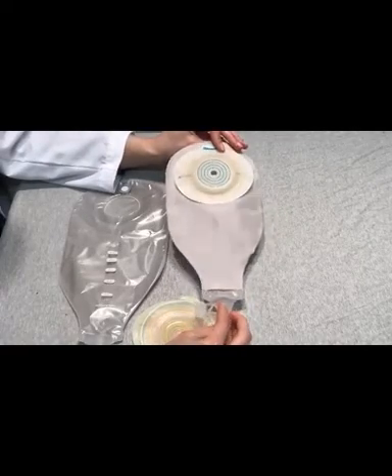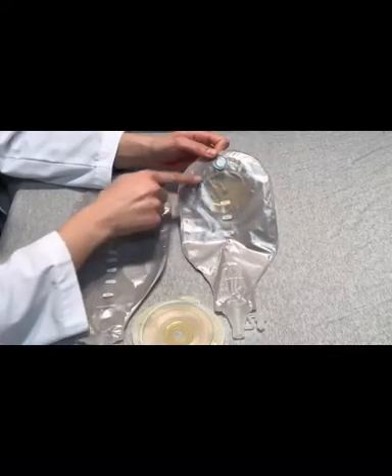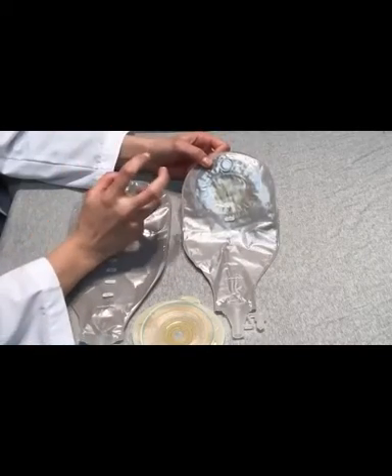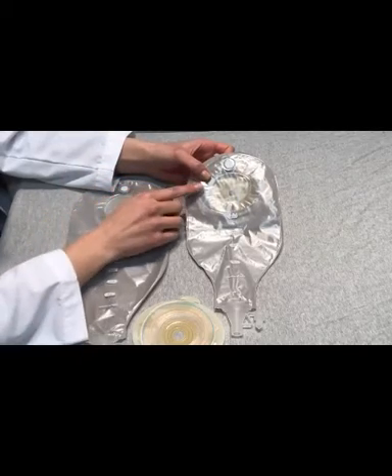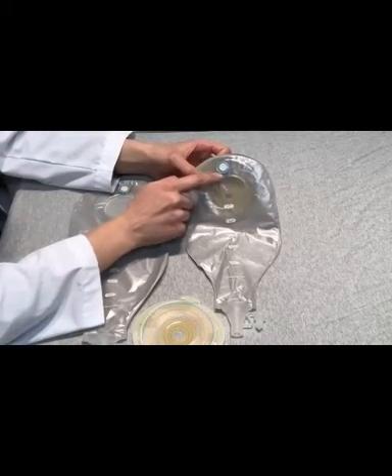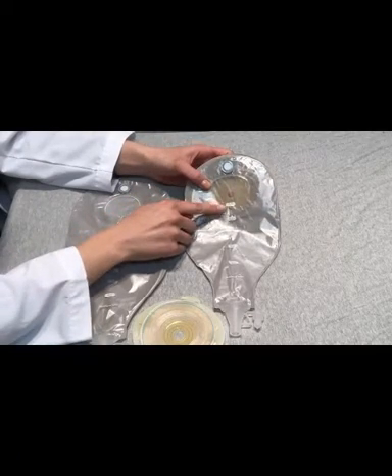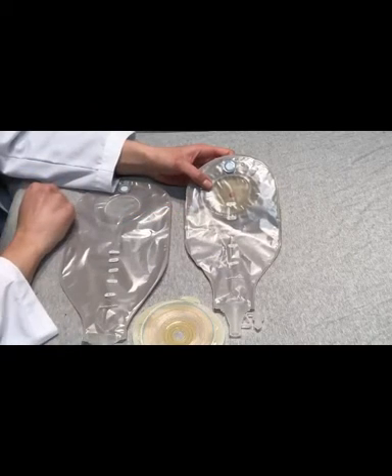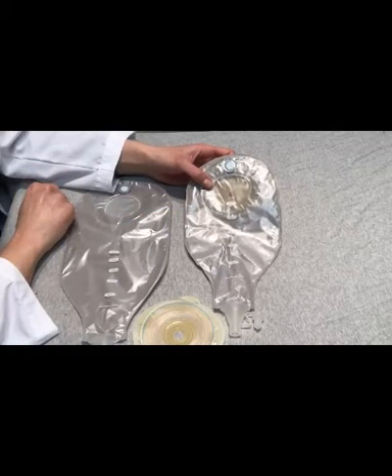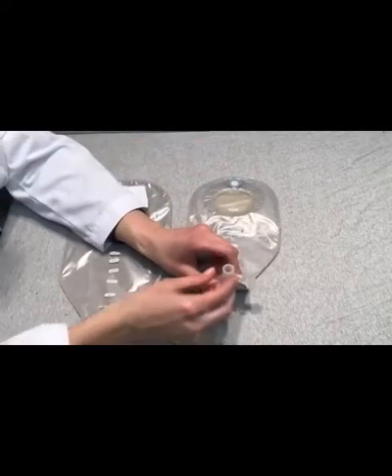The first one, again, we have our one-piece convex pouch here, that's high output. We have the filter here. This is our pre-filter. This helps catch any thicker particles in the stool, in the high output ileostomy stool. That will help prevent our charcoal filter from getting clogged up quickly. We also have a measuring guide here. This is a visual cue for patients so that they can monitor their output, especially when they're having high output out of their ileostomy. And then we have a soft outlet.